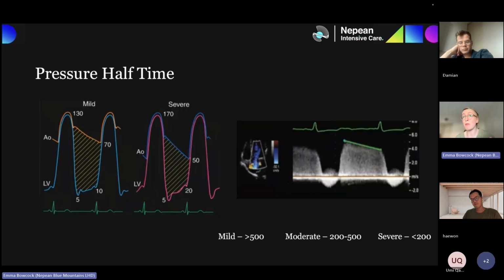So a clinical example of that would be a patient with significant diastolic heart failure, diastolic dysfunction, and a stiff ventricle who has moderate aortic regurg, but who also has a pressure half time of 180 milliseconds, right? And it's not the volume of blood that's causing them to have that pressure half time, but it's the fact that they've got raised left ventricular end diastolic pressures, that are causing that more rapid equalization of pressures.